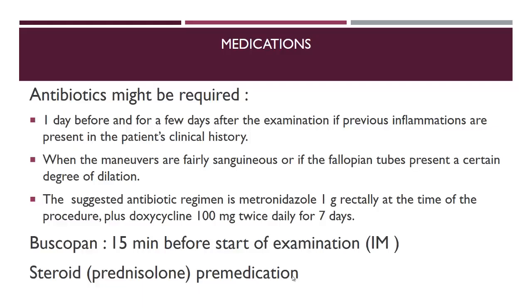Antibiotics might be required 1 day before and a few days after the examination if there is a history of previous infection, or if the patient has hydrosalpinx, as hydrosalpinx may cause stagnation and added infection.